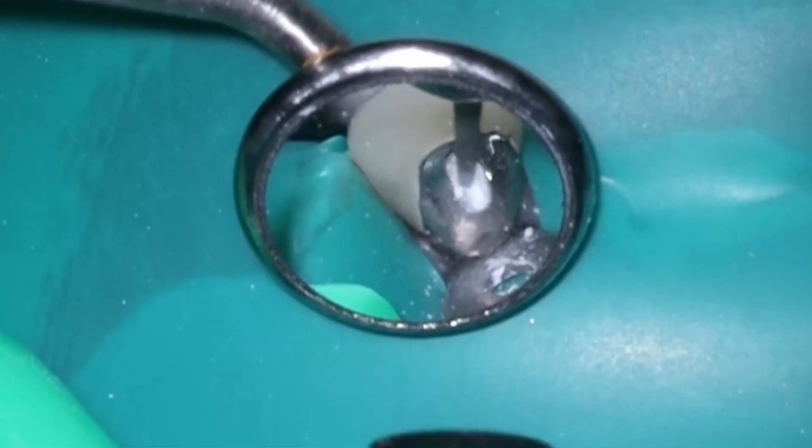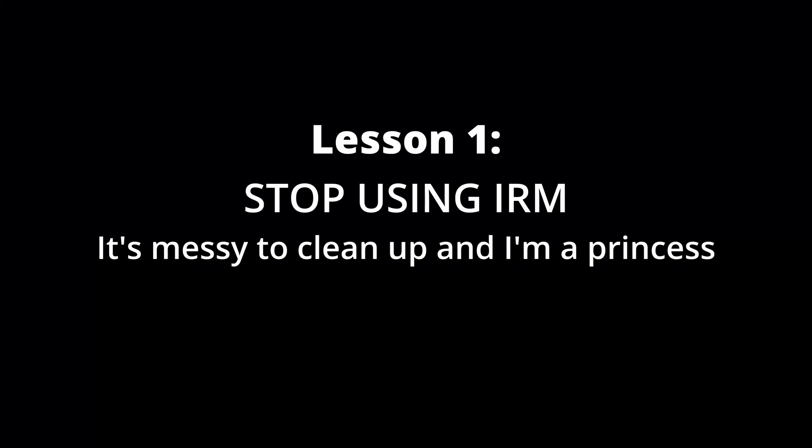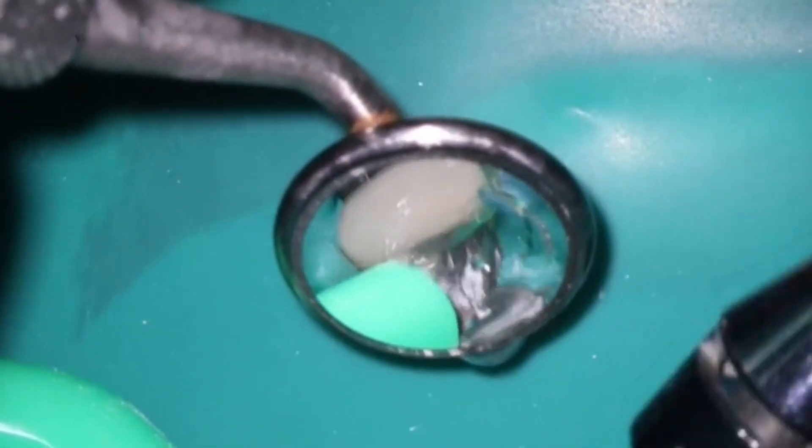We're going to be talking about a few tips for when you access anterior teeth. This is a pet peeve of mine — please stop using IRM. It's really messy to clean up and Cavit is a lot easier to use.